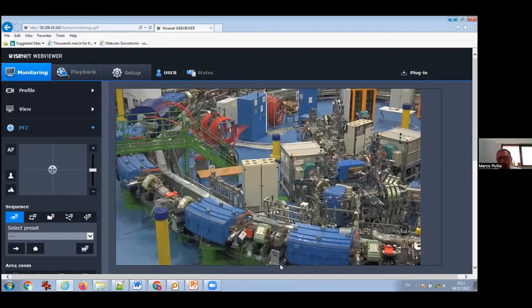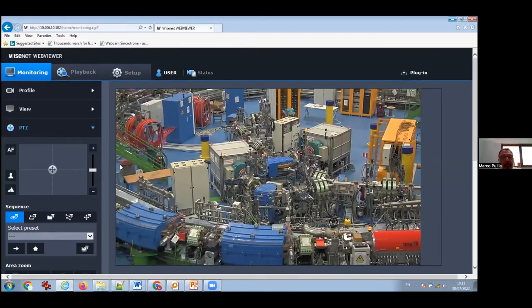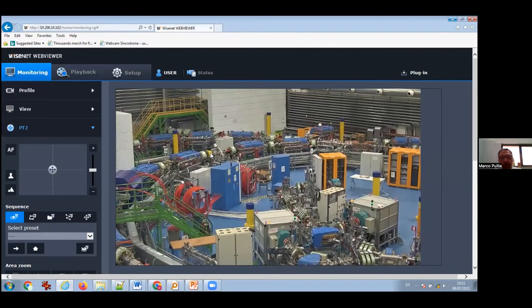We have 24 quadrupoles in 3 families. In orange, we have steering magnets, not subdivided in families, otherwise they would not be very useful. And in yellow, we have the resonance driving sextupole that we have seen, but we have 4 other sextupoles in yellow here, which are used to drive the resonance, the one that we saw before, and the other 4 are used for chromaticity.